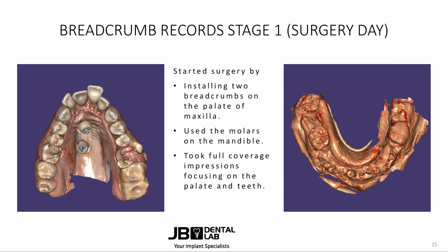Okay, now we've reached the day of surgery. And the first thing that we need to do once the patient is numbed is determine what our breadcrumbs will be. Breadcrumbs are markers that the designers will use to relay post-operative soft tissue intraoral scans into the correct preoperative vertical that we set in our treatment planning phase.